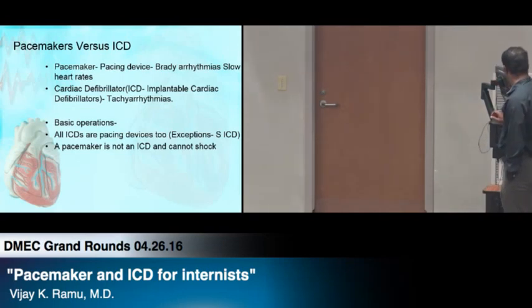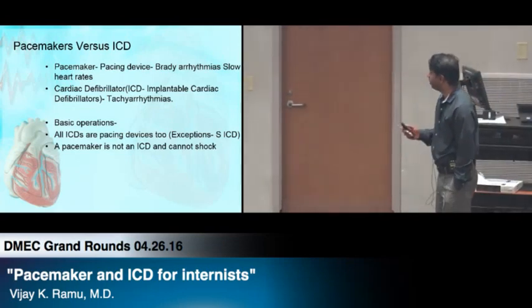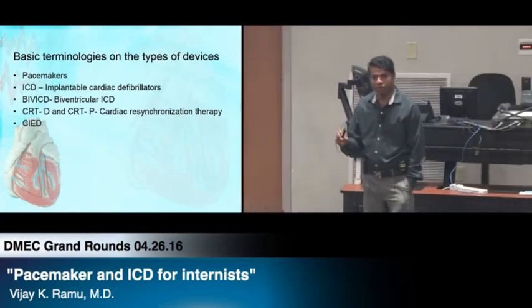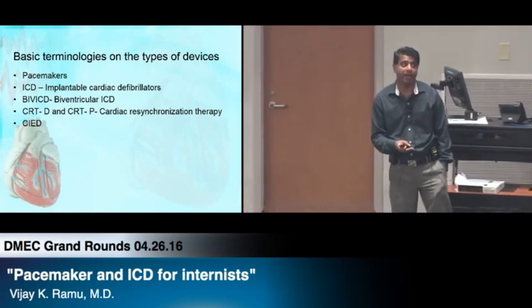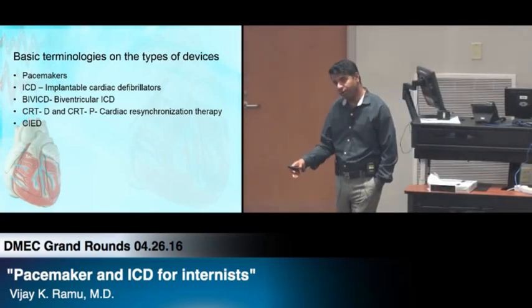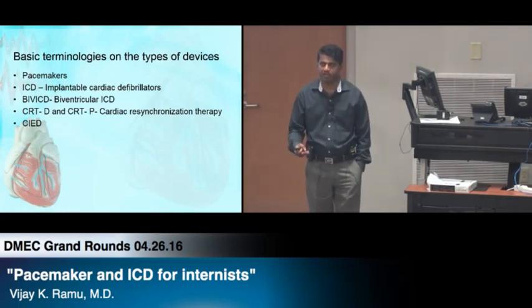A pacemaker is not an ICD and cannot shock. That's an important thing to know. Okay, so now, in the ICDs, you see this on your notes all the time, we talk about it. ICD, what does ICD stand for? Okay, ICD, implantable cardiac defibrillator. It actually makes sense now as opposed to maybe 15 years back, or even 10 years back.